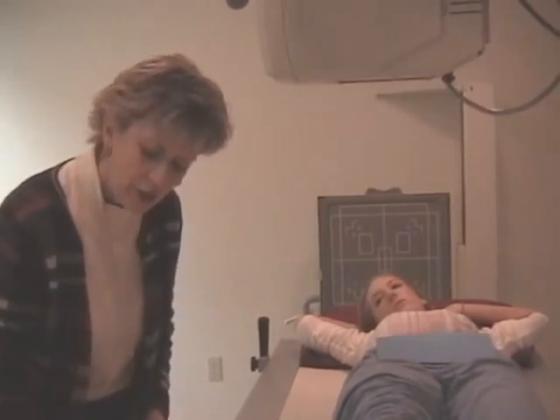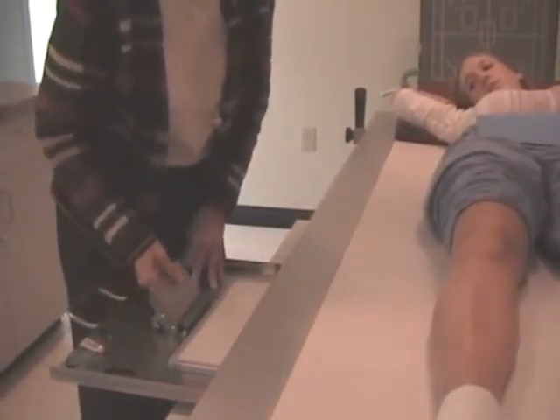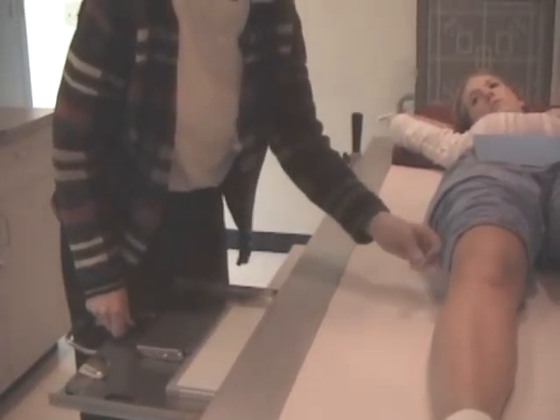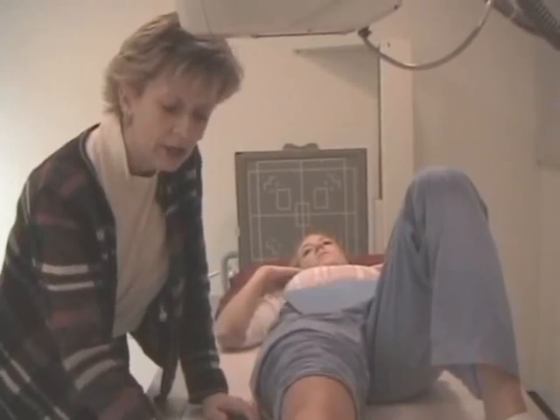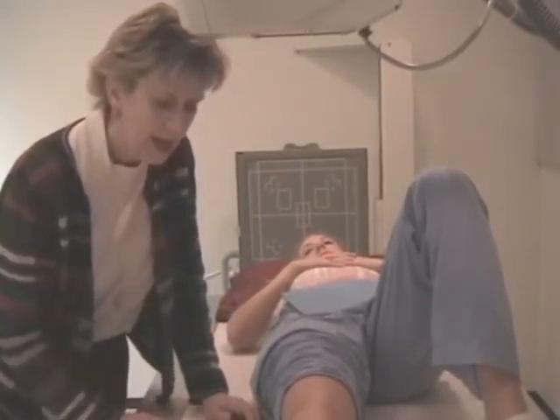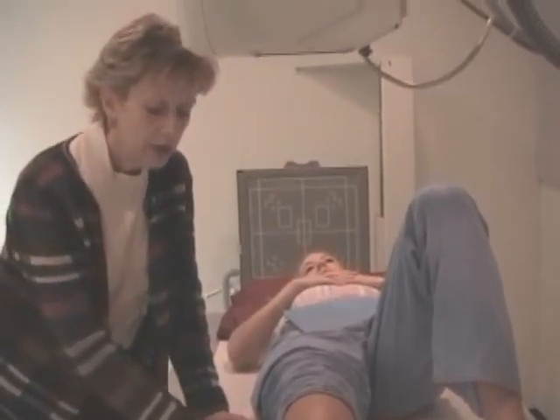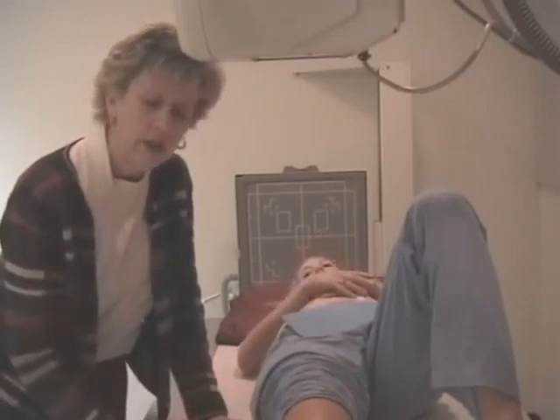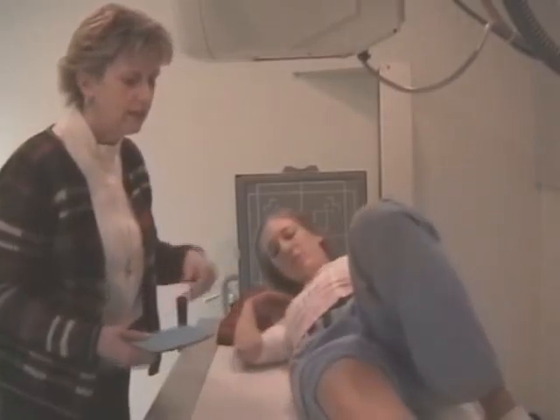We're going to change cassettes. Same 10 by 12, ID to the top. I'm going to want to keep my R marker where I had it before, to a lateral corner. With the AP, your choices again were this corner or this corner because you want it on the lateral aspect. And because I chose it here for the AP, I like to be consistent. It makes for that pretty aesthetic image. We're going to have it in this corner when we actually position her for the lateral. We're going to have her turn onto the affected side.